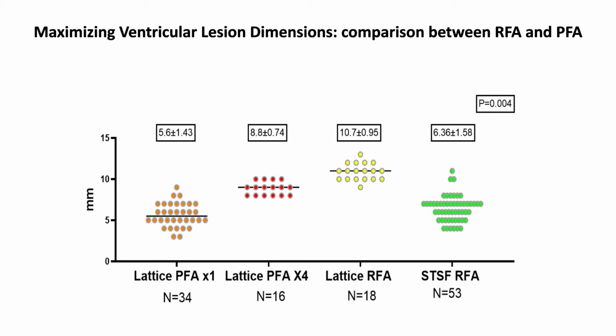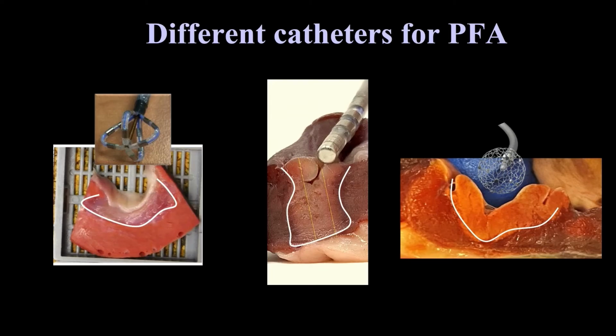As a comparison, this is STSF radiofrequency ablation, and you see that PF can in fact compare favorably to what we have at the present time. And I want to thank Ila Danter for sharing those with me.